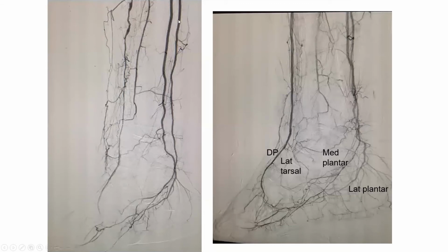This is another case that I did. The patient has a good PT and peroneal. He has good plantars, however, poor pedal loop, and the anterior tibial is, sorry, not occluded, but very severely diseased. So that's why he had an ulcer on the top of his foot, because of diseased anterior tibial, and even though the PT is great with a good PT pulse, no good communication. So what I did, I recanalized the AT and I recanalized that pedal loop to allow that foot ulcer that is here to here to heal. Okay, so DP, lateral tarsal on top from the AT, and medial plantar, lateral plantar.